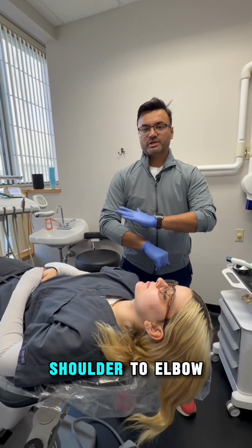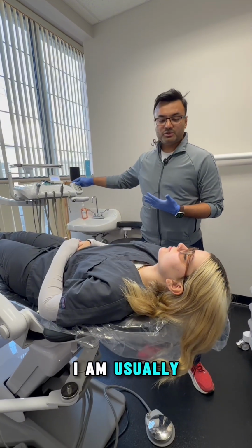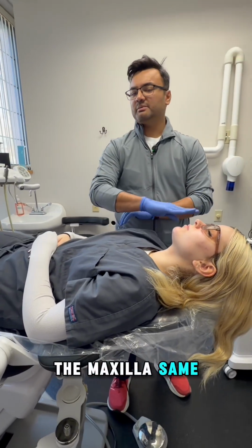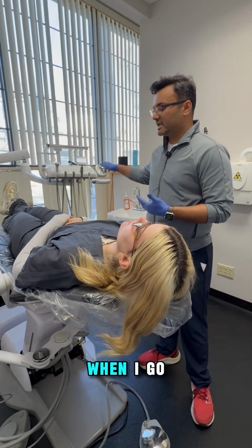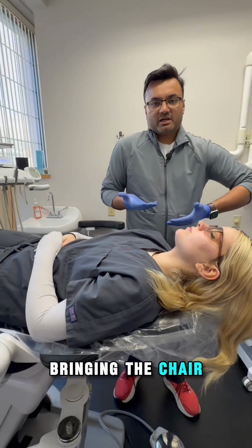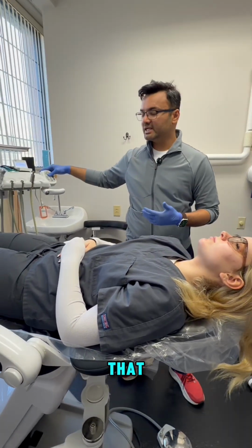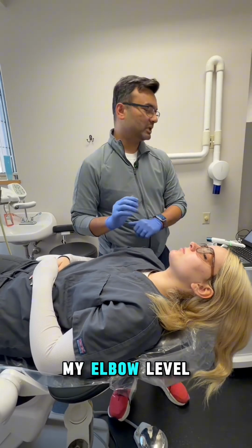We talked about shoulder to elbow level. When I am working on the maxilla, I am usually going to keep my patient somewhere about the maxilla, same level as the elbow. There are times when I go as high as bringing the chair all the way up to my shoulder level. I don't usually need to do that. That used to be an old denture concept. But the idea again is that I keep everything at my elbow level.